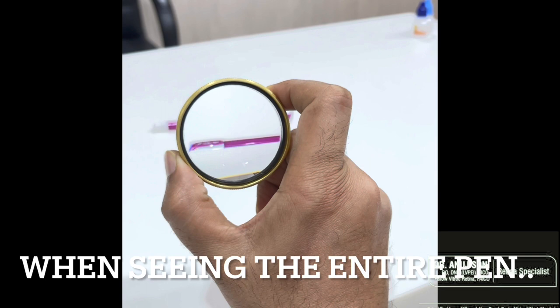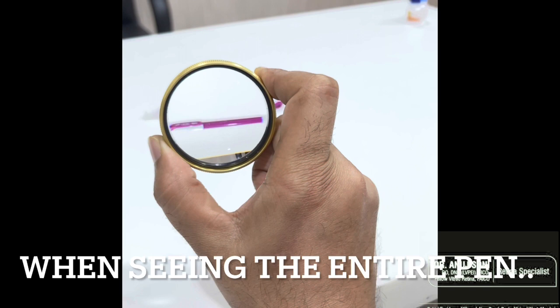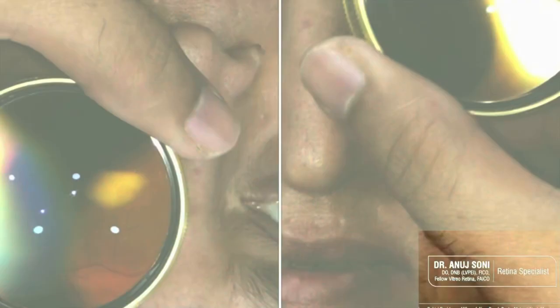Now if you are seeing this pen in entirety, you will see the entire pen is inverted and that is what happens when seeing the posterior pole. At the posterior pole, whatever appears superior is inferior and what is inferior is superior.